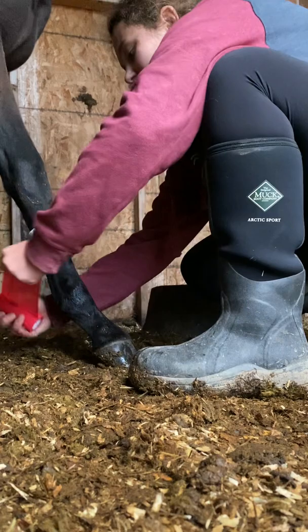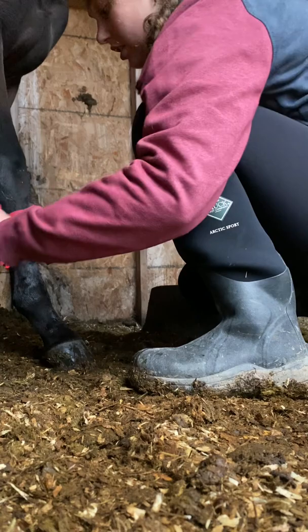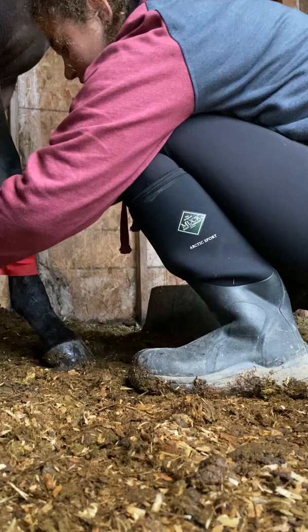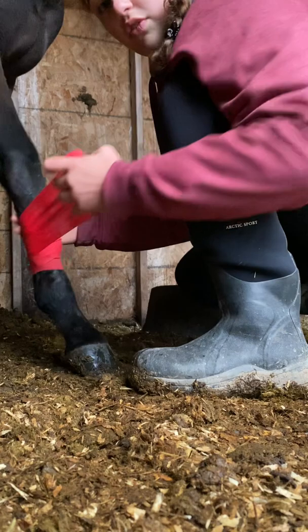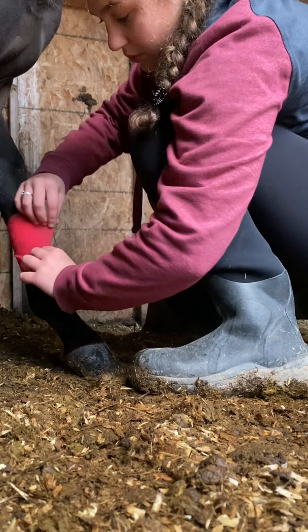To secure the Teflopad, I put on a few layers of vet wrap around it. Make sure not to put it too tight, or you could cut off some circulation. And you want to get a good couple layers on there in case some falls off. And to make sure that Teflopad is nice and secure, try and make sure that there's no wrinkles, because that can really bother a horse and even worsen the injury if there's wrinkles in the vet wrap.